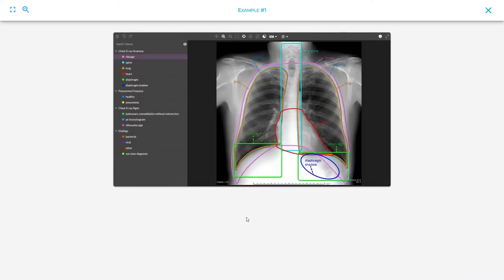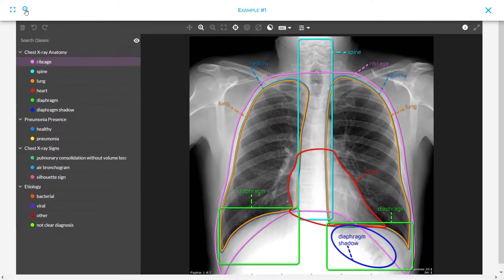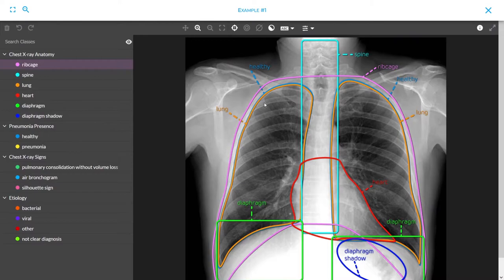By clicking on the preview image of the annotation, saved and contained in the collapsible element of the form, you access the editing mode, in case of second thoughts.